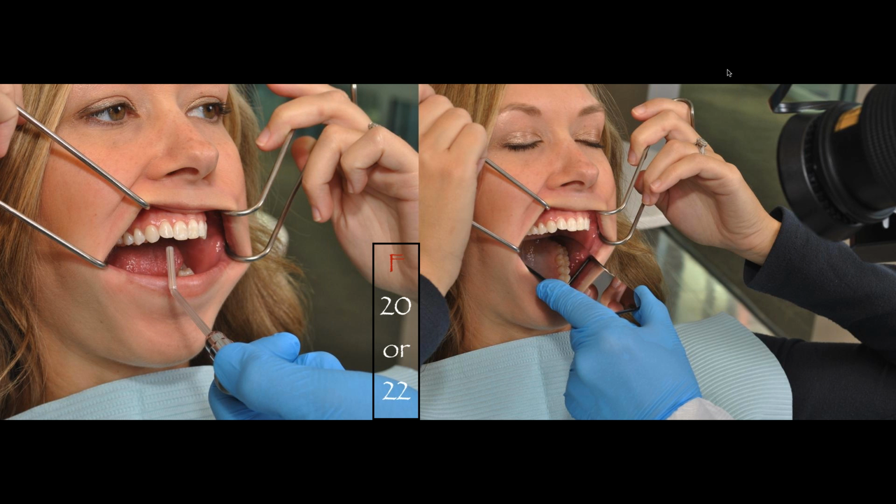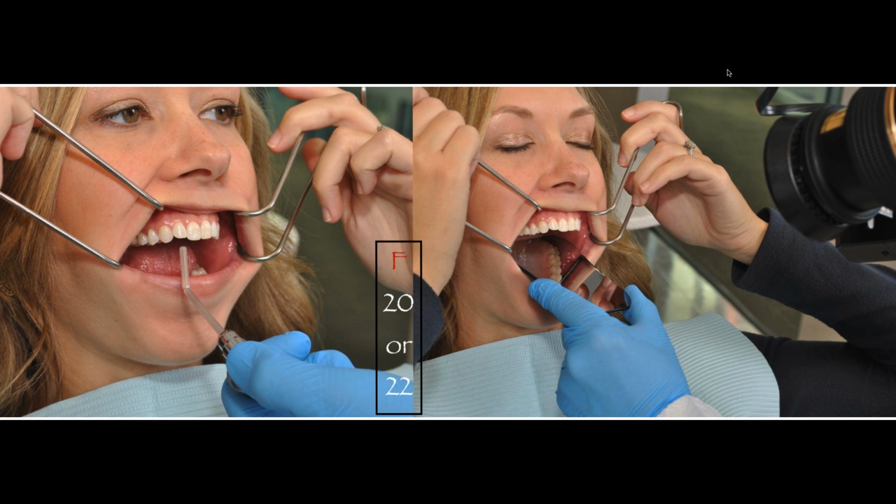We dry the facial and occlusal surfaces of the teeth. Then we place the mirror inside the patient's mouth with that angulation. I'm holding the mirror with my left hand, and I'm holding my camera with my right hand. And I have the patient breathe through her nose. Now, this photo has to be taken very quickly, because if the patient starts breathing through her mouth, you're going to get this mirror blurred.